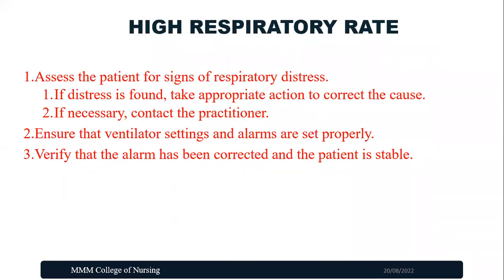High respiratory rate. Assess the patient for signs of respiratory distress. If distress is found, take appropriate action necessary. Call the intensivist. Ensure that the ventilator settings and alarms are set properly and patient is stable.